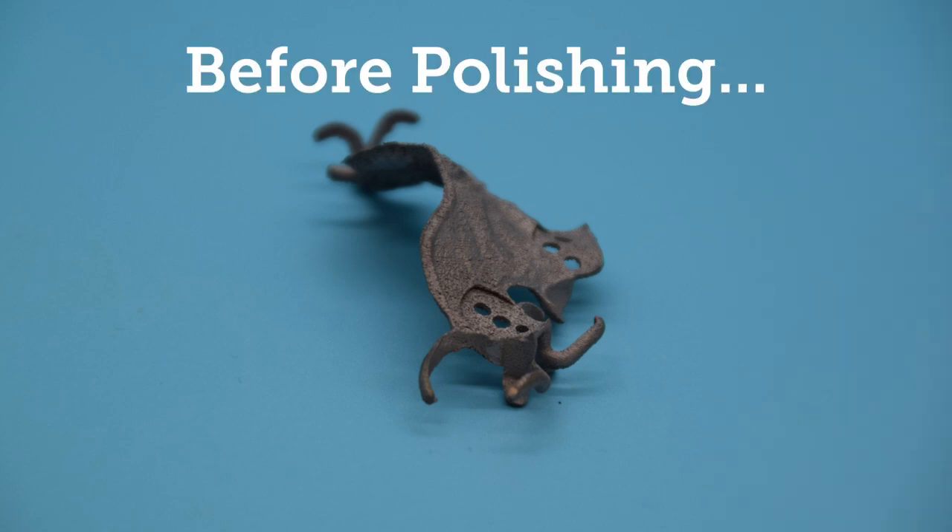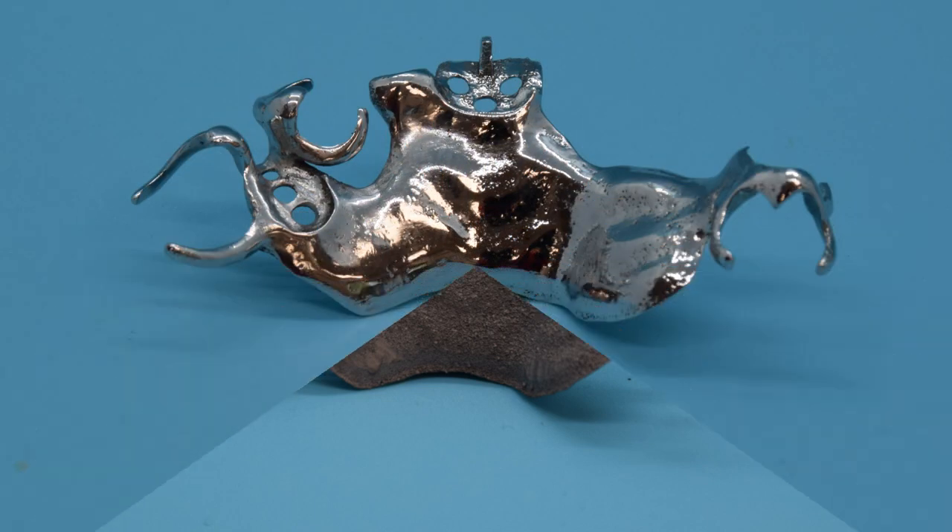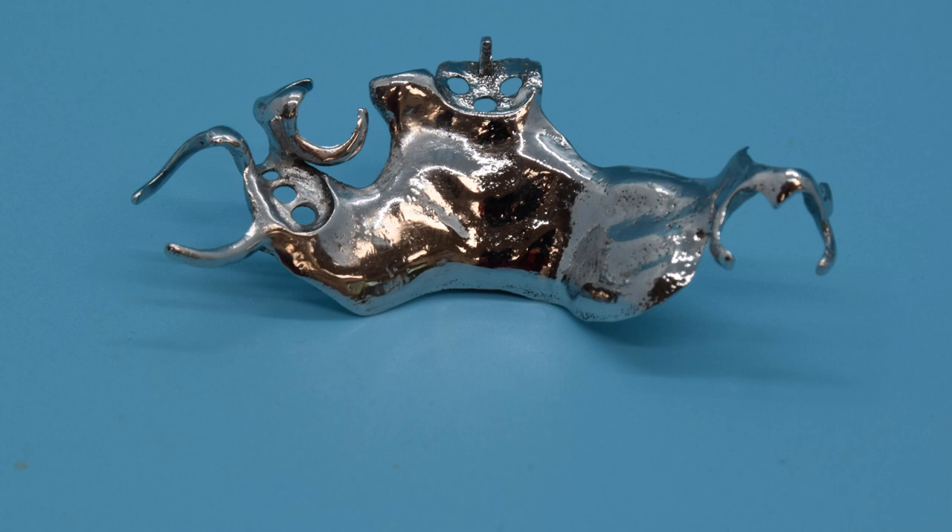The final result achieves homogeneous results across the surface and eliminates micro scratches. Not only are our frames polished to a mirror-like finish, they are also more resistant to corrosion.